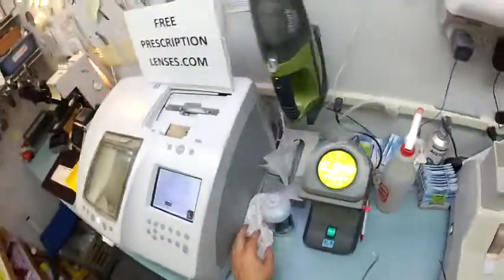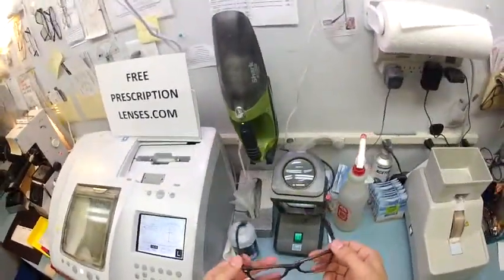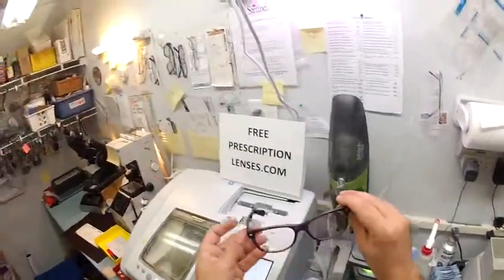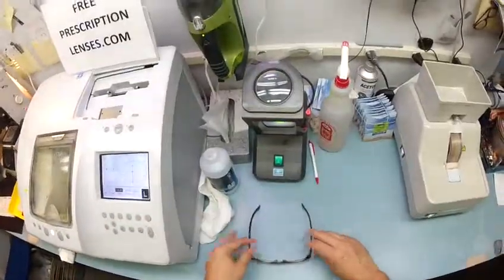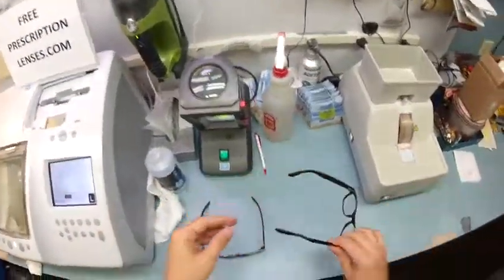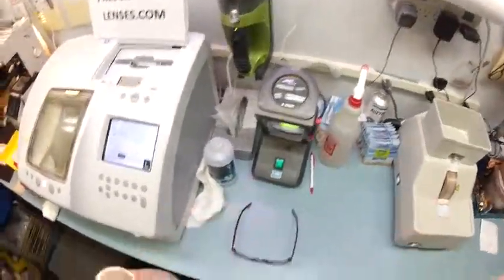Now, before I activate, there is one more thing I want to do. I do want to tell you that 99% of all optical shops will do free adjustments if you ask them. So if you get these and they're too loose or too tight or high on one side, because 80% of people have one ear that's higher than the other, I am no exception. When I take mine off, put them on the counter, mine have a little bit of a wobble because I have one ear that's higher than the other.